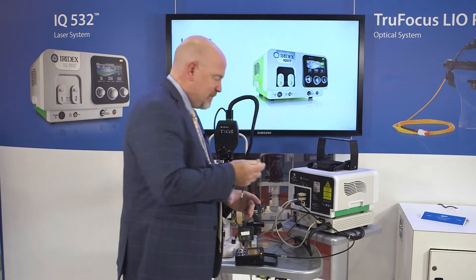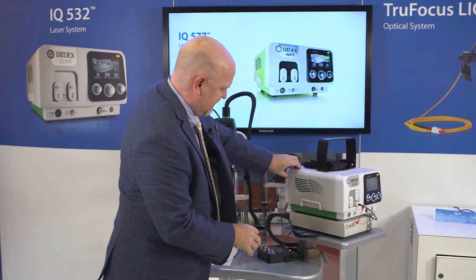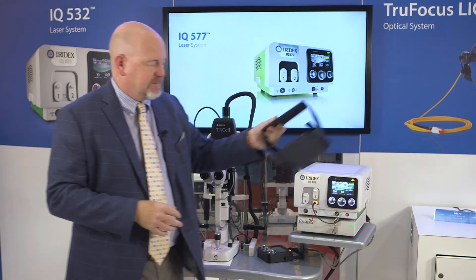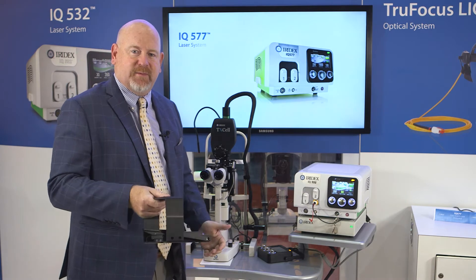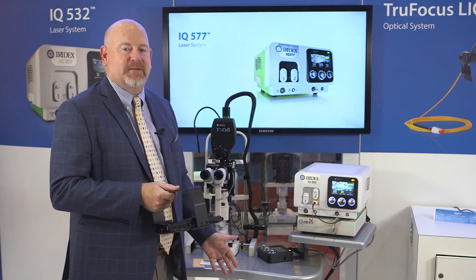You simply take the parallel port and snap it in, and now they're not tethered. It makes it easy to transfer from room to room and not have a cable that the patients can trip over.